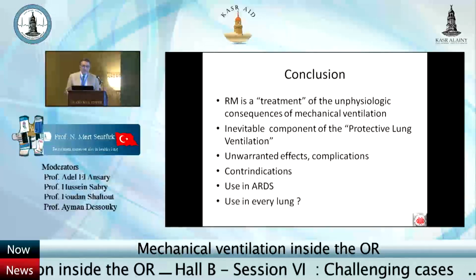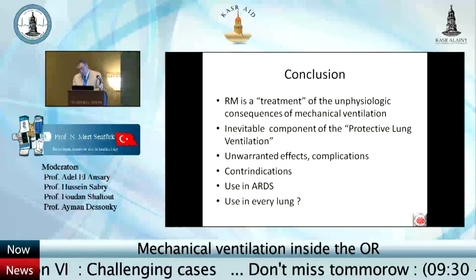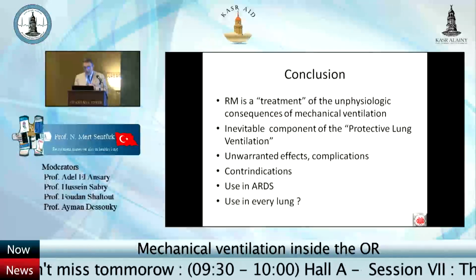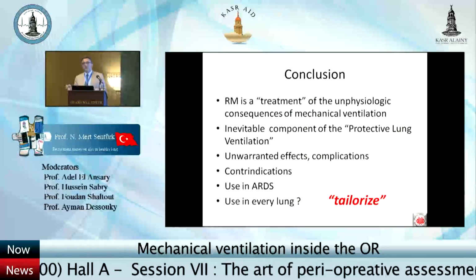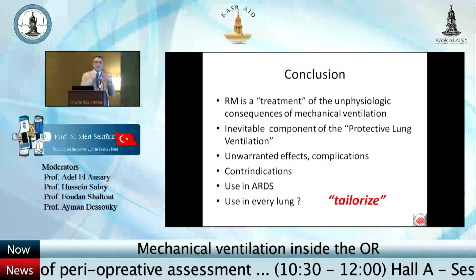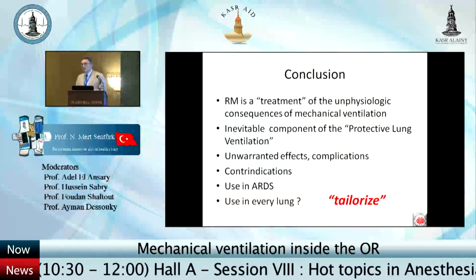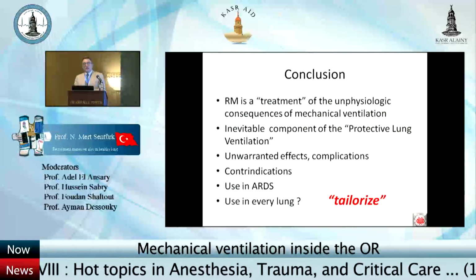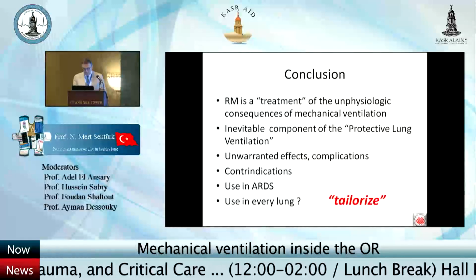It's now questioned, but with recent knowledge, if we can use it in a proper way, I mean in a tailored, personalized way, like the other components of protective ventilation, the benefits of the recruitment maneuver will be more obvious than its possible damages.